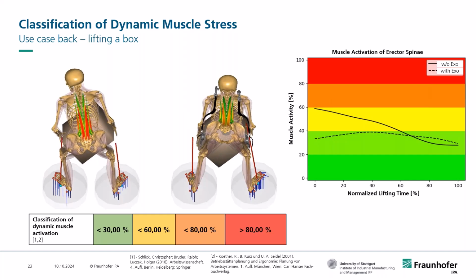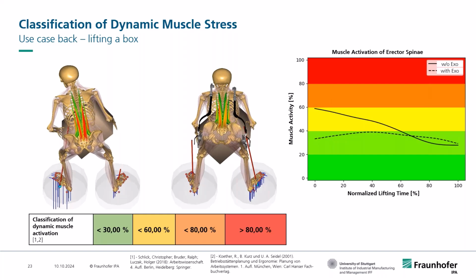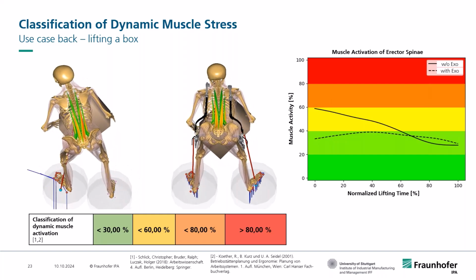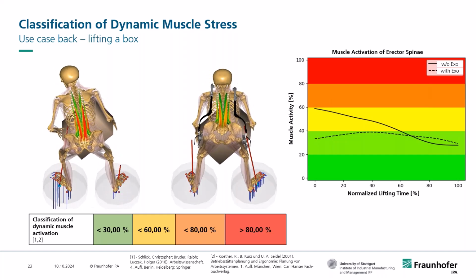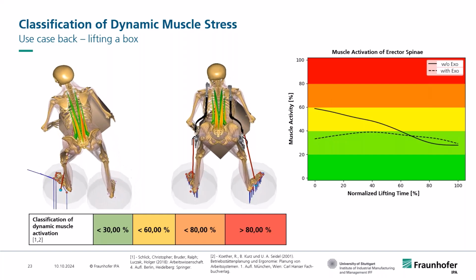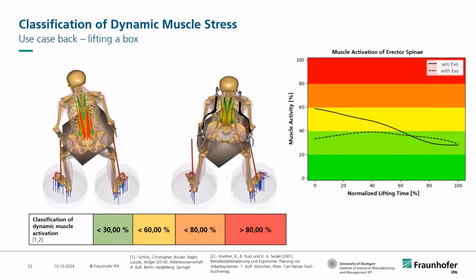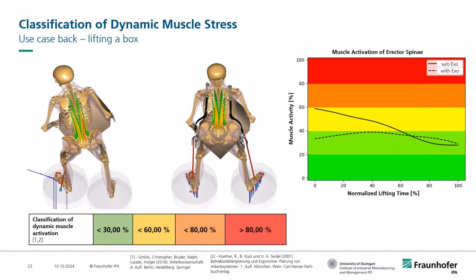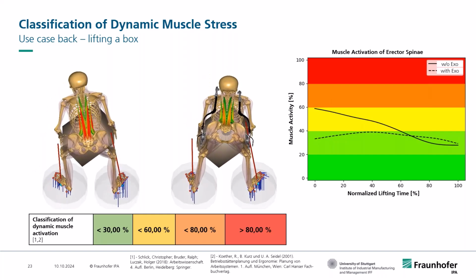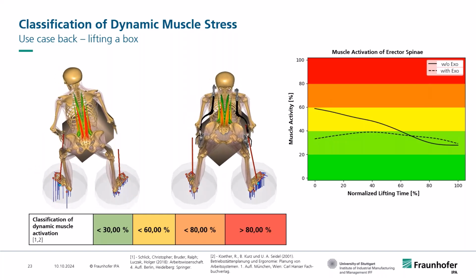And you see that at the beginning, of course, you have a strong decrease, but in the end, sometimes you could also have a minor increase in the biomechanical stress, but on a different level of general stress the body can take. So therefore the system offers also a good quantification to get an idea what really happens to the muscles on different levels of activation.